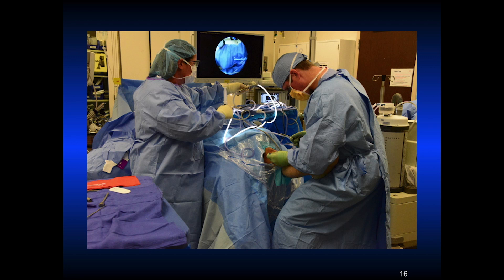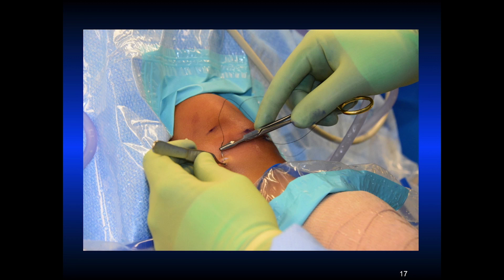And then the closure. Basically I don't put vicryl or anything deep — sometimes these will get red and spit sutures, so I put nylon, usually in a mattress fashion, and just re-approximate the skin. It's nice to do a mattress if you have a lot of fluid leaking out of that medial portal. This just shows the suture — 3-0 nylon typically. You don't have to make a lot of landmarks on the knee for a knee scope; you just need the inferior pole of the patella, then come just lateral to the patellar tendon at that level. The medial portal is usually about a centimeter lower.